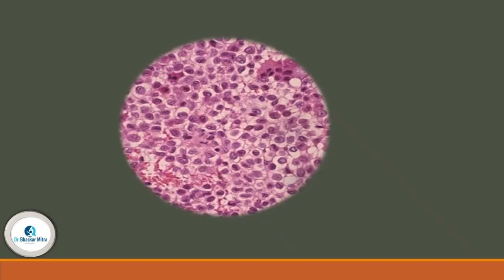Again, the chondroblastic cells, here we can directly make out the individual cell border. The cell border is very prominent. We can see the boundary of each of the individual chondroblasts here. The giant cells are there, and these are the chondroblasts. This is the classical picture of chondroblastoma.